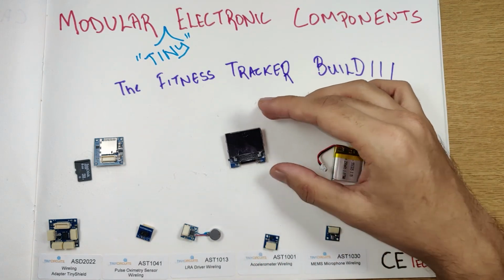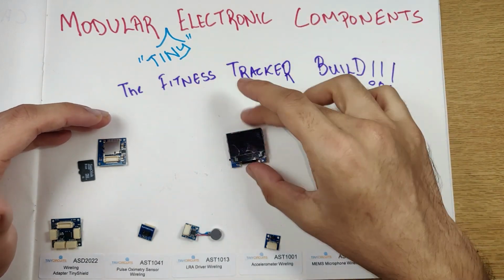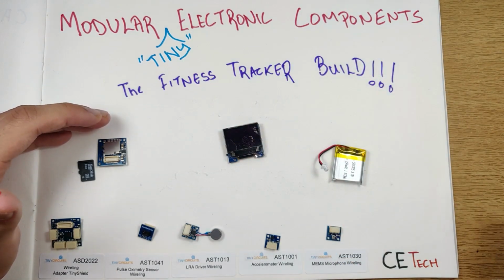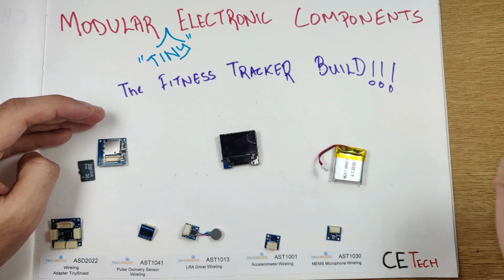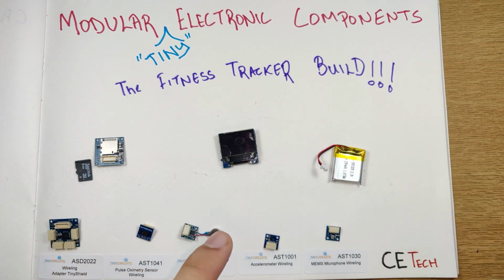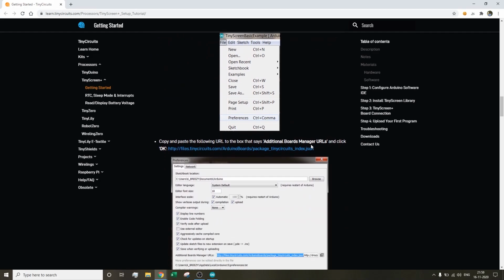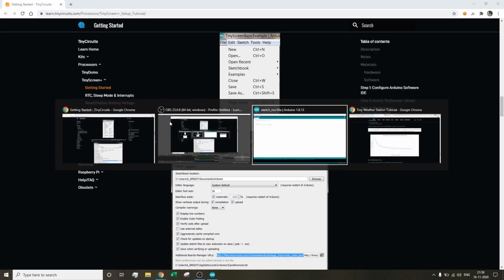This installation will not only be useful in your fitness tracker build, but all the builds that you require with the tiny screen plus. You'll have to set up and prepare your computer to program the tiny screen plus, and that is what we'll be doing right now. So their website has a pretty detailed instruction of what we need to do to initialize this. From there, we need to copy this particular URL and head over to the Arduino IDE.